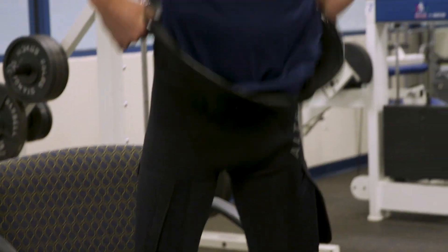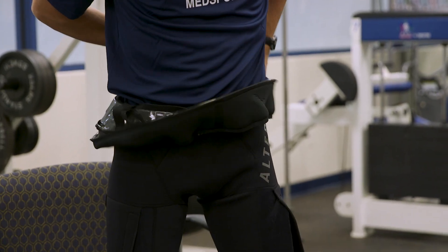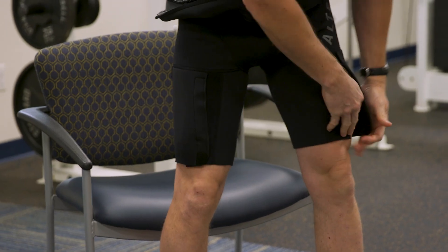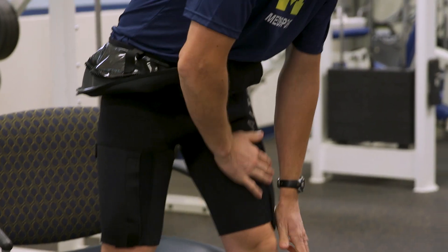The first step is we're going to have you put on the AlterG shorts, kind of like compression shorts. It comes in multiple sizes all the way from extra small to 4XL, so it can fit basically any and all patients.